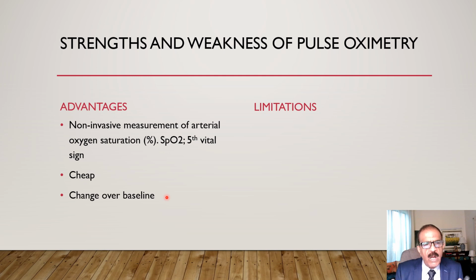Whatever stable values you get, if the values fluctuate between say 94 and 93, I would take the higher value, because there is no way that the value would increase by any technical issue. Maybe if the contact is not proper, it could give you a low value. So I would use the high value, but provided it is stable.